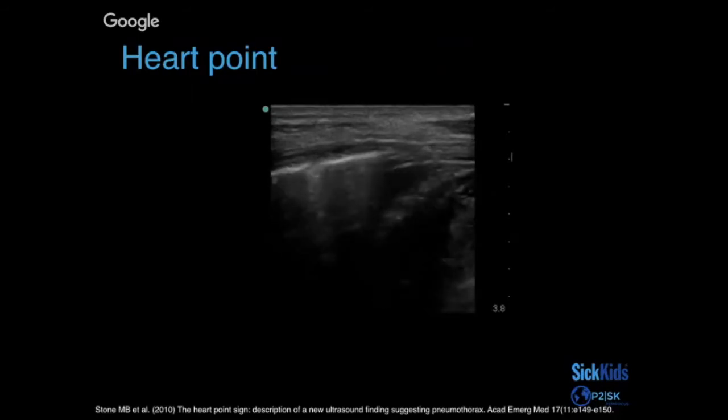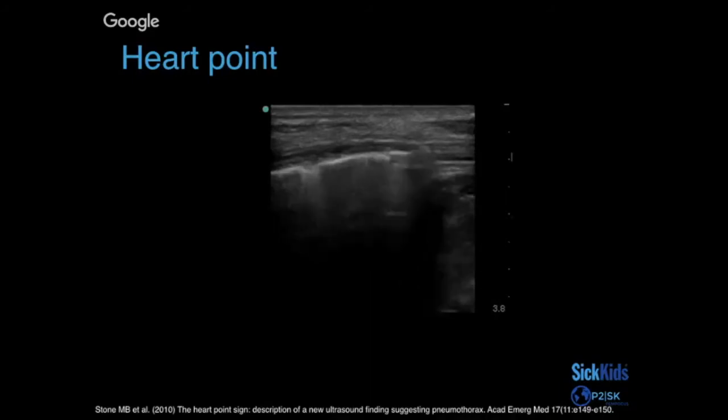So when something is odd, definitely look a little bit harder. When he thought that was odd, he changed to a linear probe and confirmed that there is definitely a lung point there.